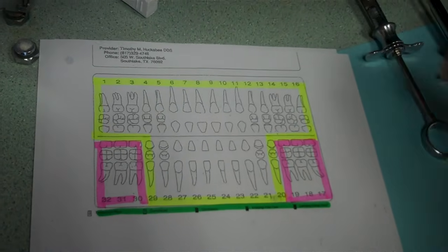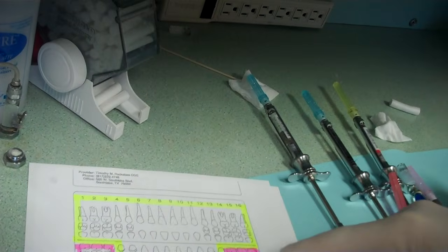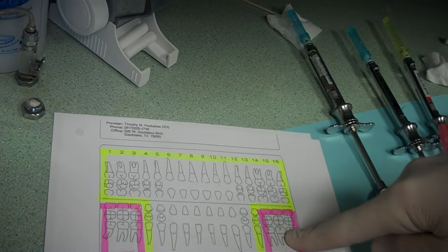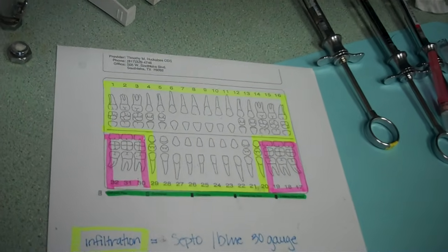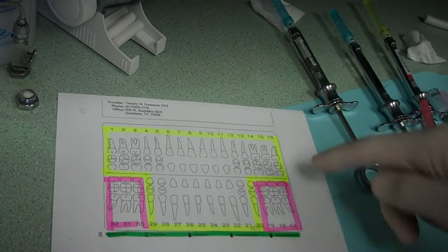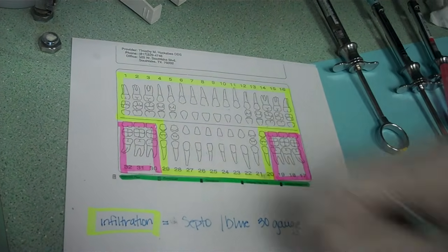It's good to go. Anything that requires a block, now with the block I'm going to actually add on to that with our purple, because it actually should go all the way here, because it doesn't just block these three, it blocks all of this. So if I have to do tooth number 18, there's no need to give any more anesthetic to these teeth, because it's going to go all the way forward to the halfway mark, if that makes sense. And then Ligject is used just to supplement. Sometimes patients have a harder time getting numb on the lower particularly, so that would be used to supplement any of these, and we give it right to the tooth.